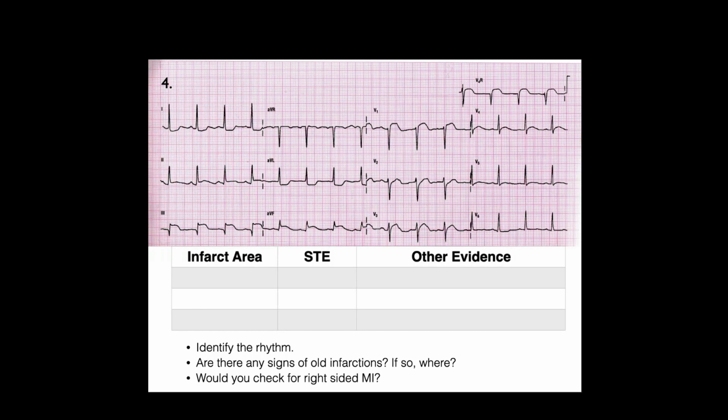Okay. All the other ones, every single one I have them circled. So, Koa. All right. Infarct area for 4, I had inferior ST elevation in leads 2, 3, and AVF, and then evidence for that was also ST depression and reciprocal changes in 1 and AVL. Good.